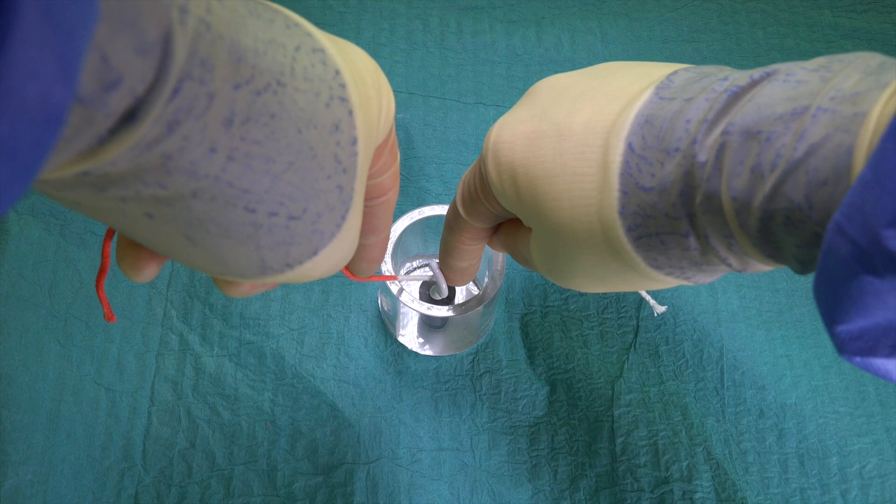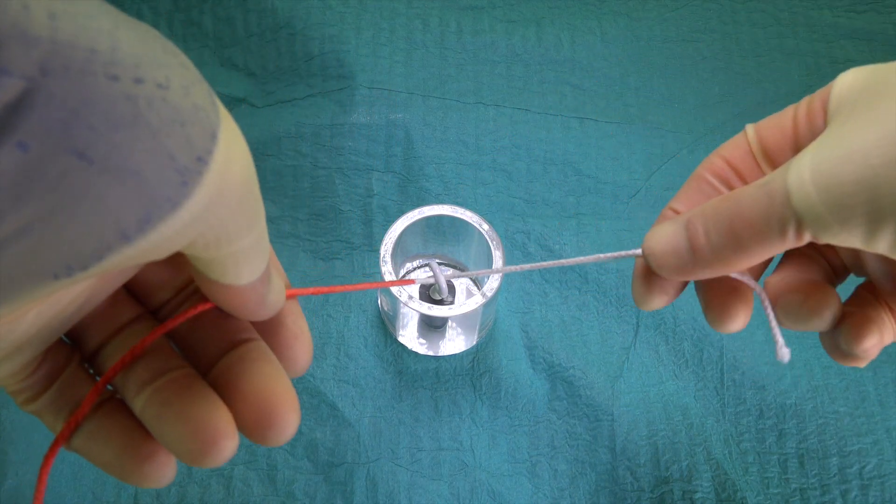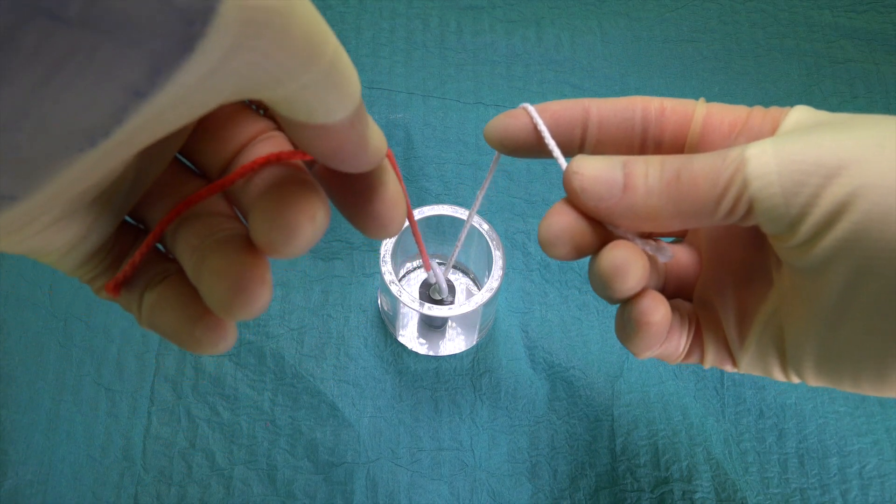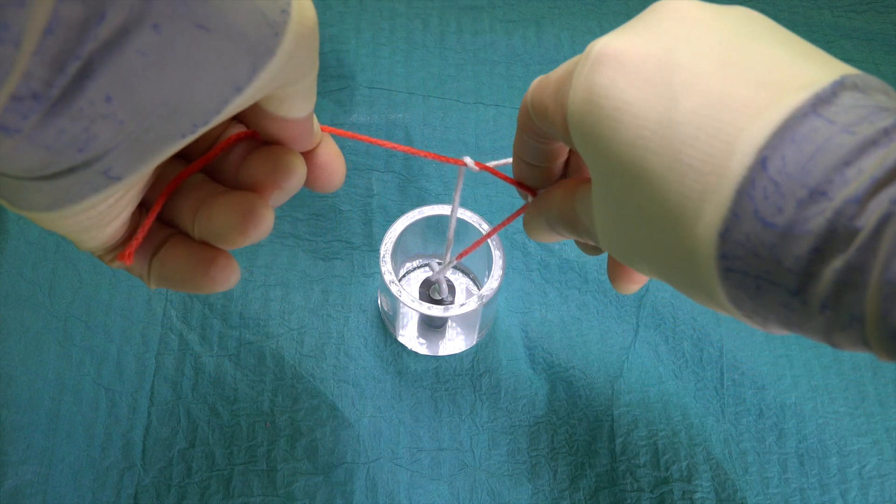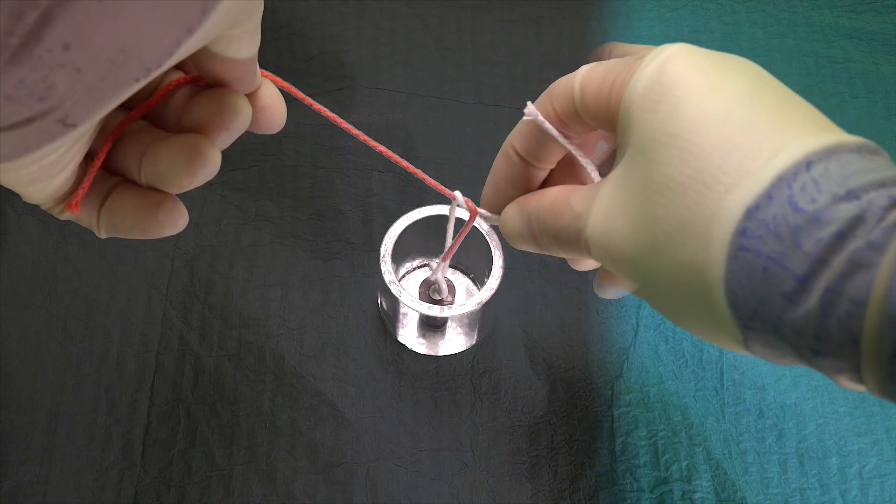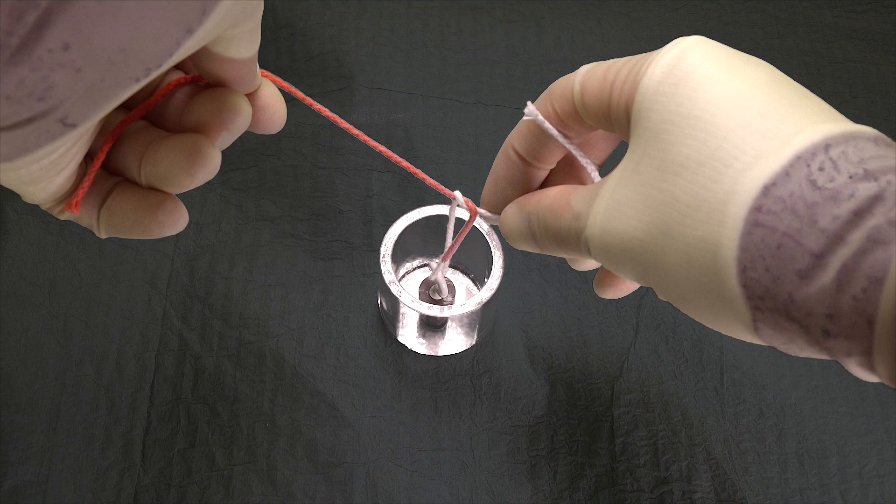Now looking at tying at depth with our right hand. As we've already mentioned, the hand actions in performing the knot are the same as when we perform a standard reef knot. But the key difference is in maintaining the upward tension with our left hand, as the right hand snugs down each of the throws.